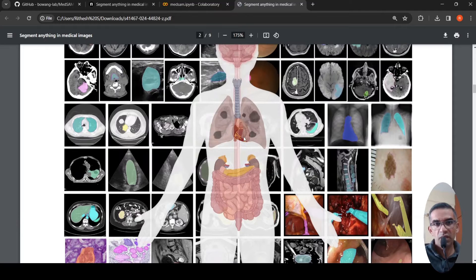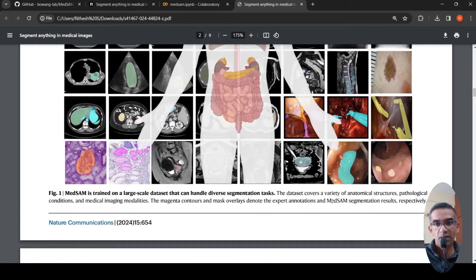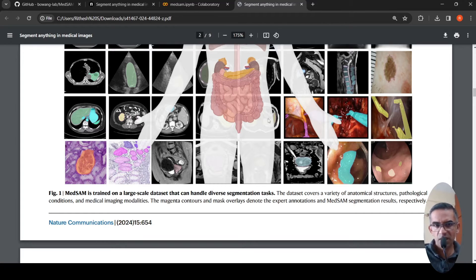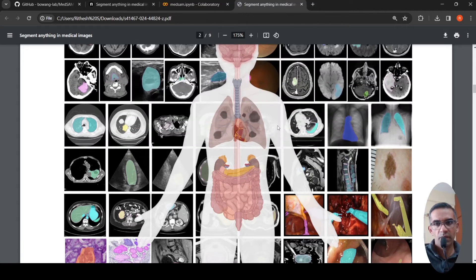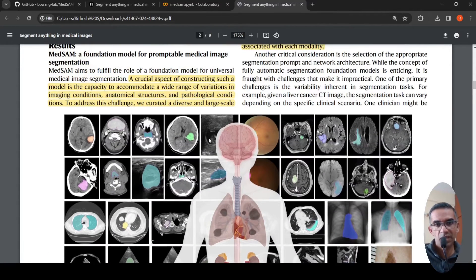The visualization shown here includes the mask, which denotes the expert annotations, and the MedSAM results respectively. These results show how accurately it segments or extracts the region of interest compared to human segmentation.